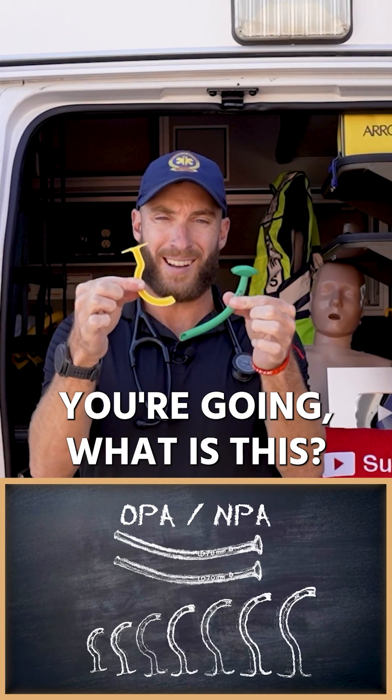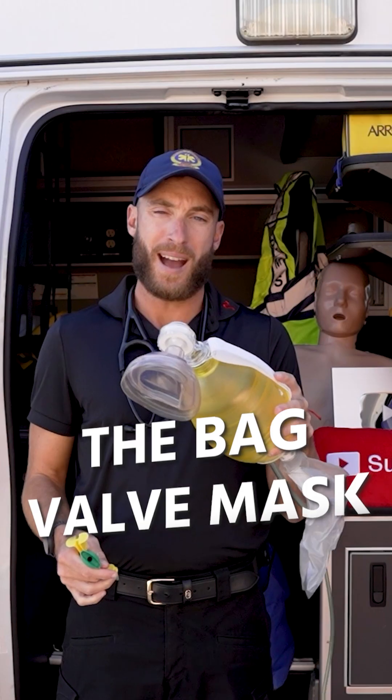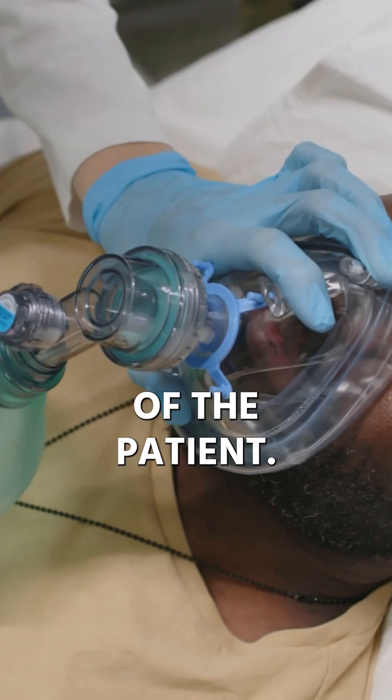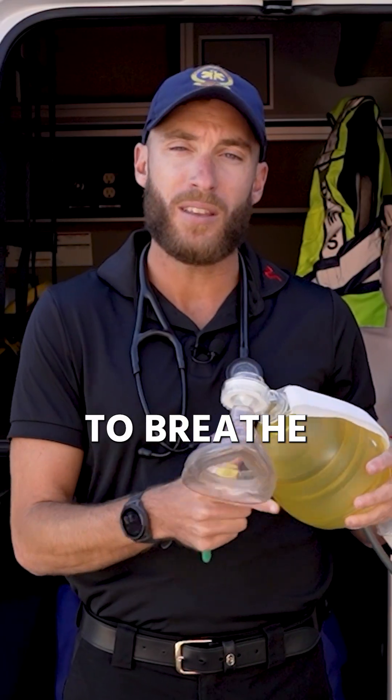If you're bringing to EMS going, what is this? Remember earlier here, we talked about the bag valve mask. This is our BVM. This is going to go over the nose and mouth of the patient, and we're going to use this attached to oxygen to breathe for the patient.